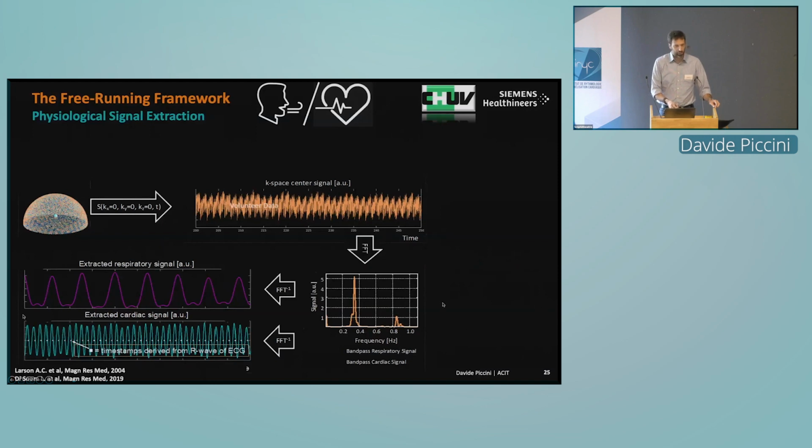Yes. Of the frequency content of this series of SI projections. And then what you should see is that besides some trajectory related frequencies, there are two peaks, one at the respiratory frequency and the other at the cardiac frequency.